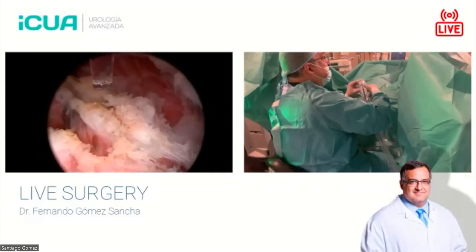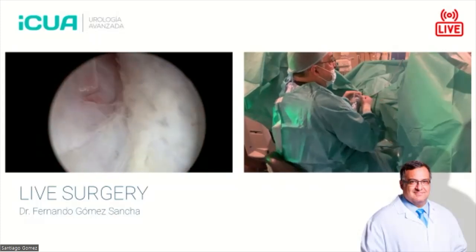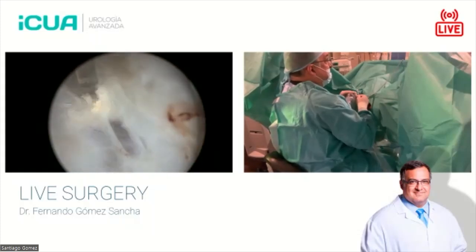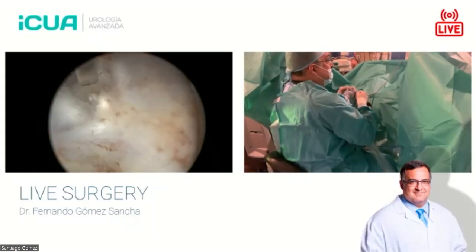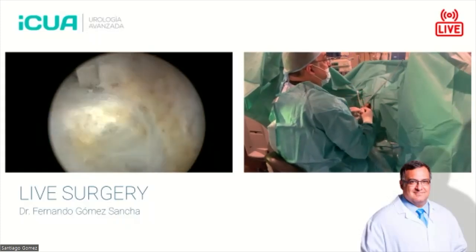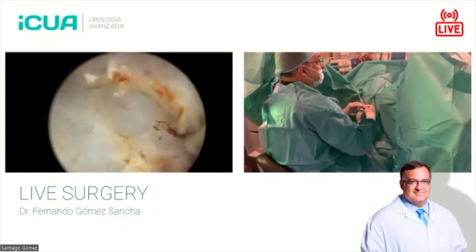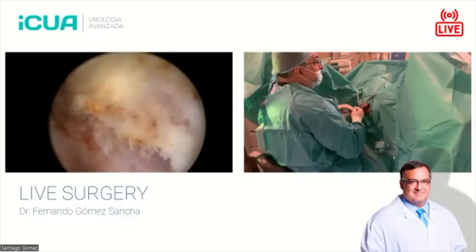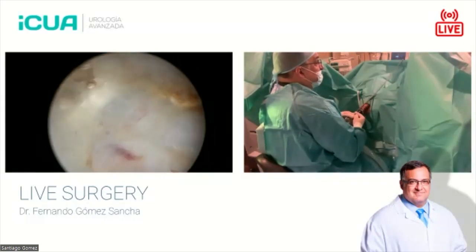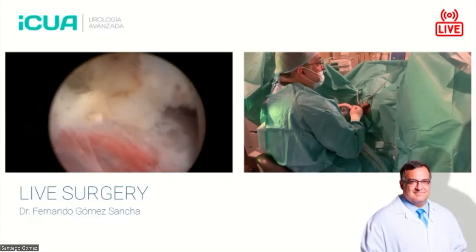Here we still have to do some dissection down here, you see that the plane is a little bit sticky. Let's see if I can finish this so we can continue. And again, this is my line of dissection. I'm using the energy very softly so that I don't deepen too much. And if I deepen a little bit, I can correct. And of course, a little bit is not dangerous. Dangerous is when you do a big opening or a deep opening. But if you do a, let's say, superficial indentation in the capsule, it's not going to have any consequence.